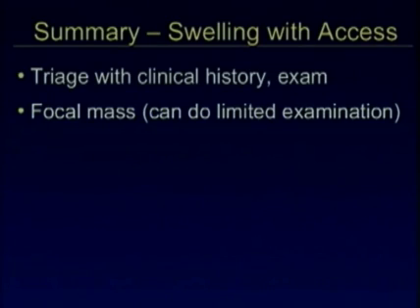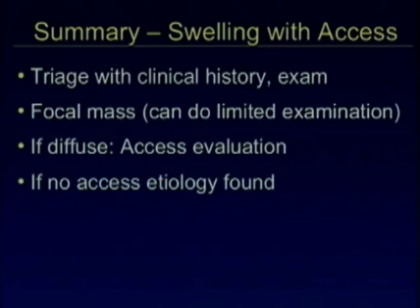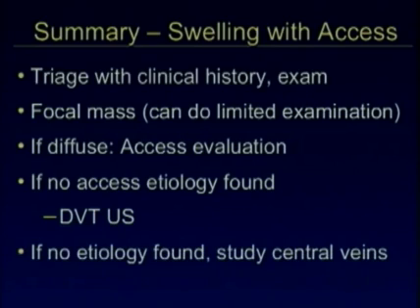Now, I do put the Doppler on just to assess patency, but I don't charge for that because it's a 1 second on and off. So remember, those can be a much more shortened exam. But if it's diffuse, you will need to do an entire access evaluation. And then if you don't see an etiology for the swelling in terms of access malfunction, then you need to go on and do a DVT study. And if you still don't see any etiology for that swelling, you need to study the central veins.